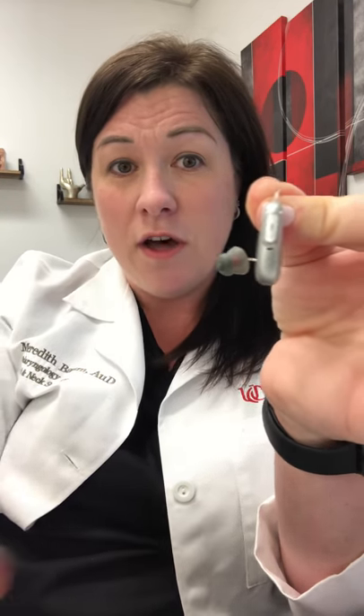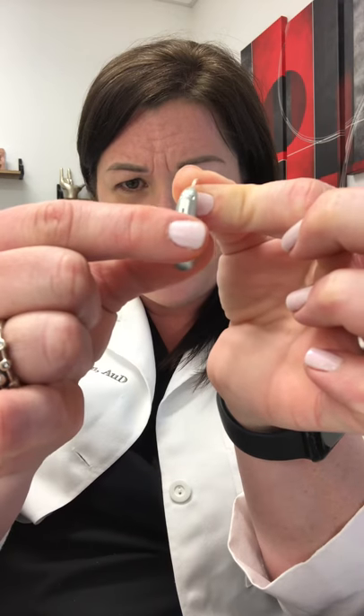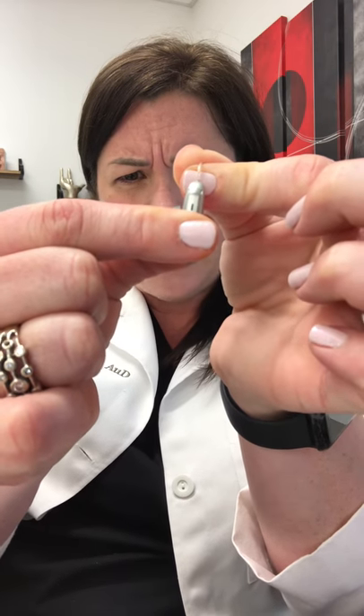The button on the hearing aid that serves as the program and volume control is also an on and off switch. All you need to do is press the bottom of that button for about five seconds and the light turns red and it's off.